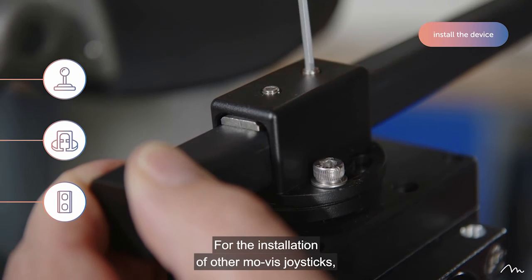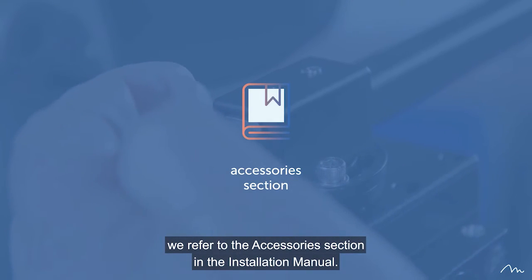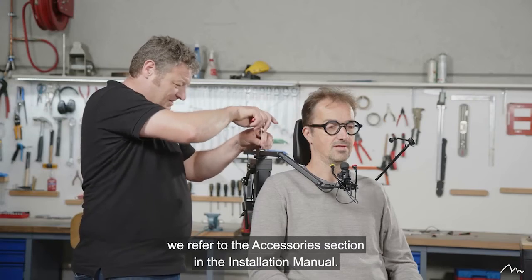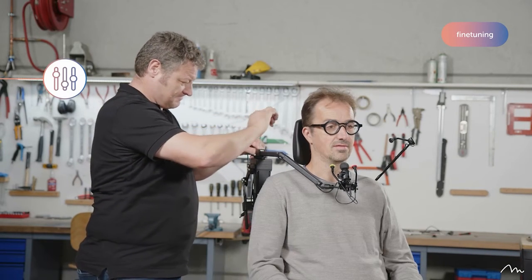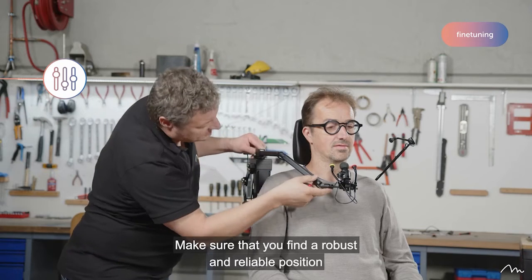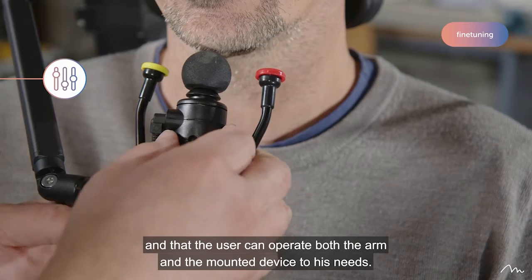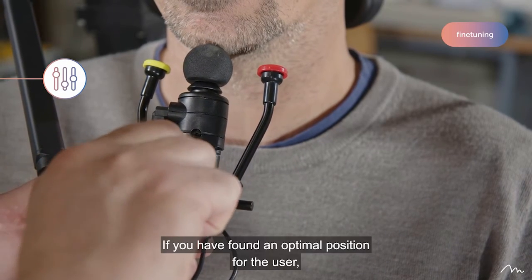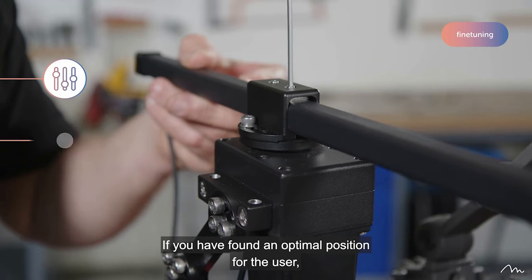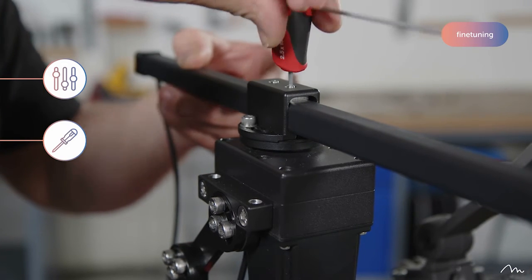For the installation of other mo-vis joysticks, we refer to the accessories section in the installation manual. Now, further tweaking of the multi-swing might be necessary. Make sure that you find a robust and reliable position and that the user can operate both the arm and the mounted device to his needs. If you have found an optimal position for the user, tighten all the screws to make a stable construction.